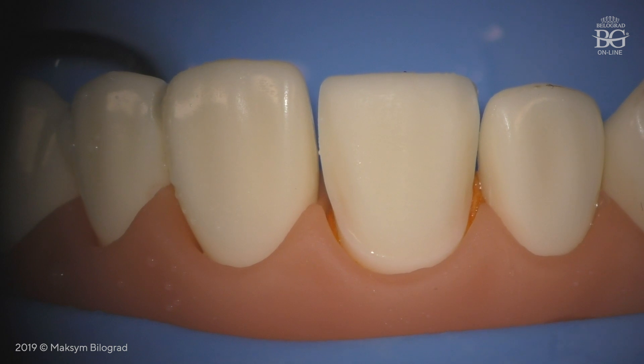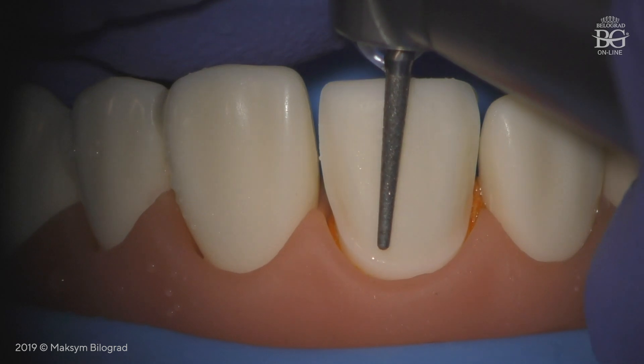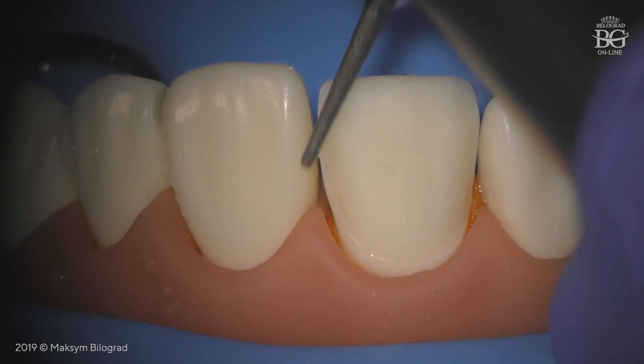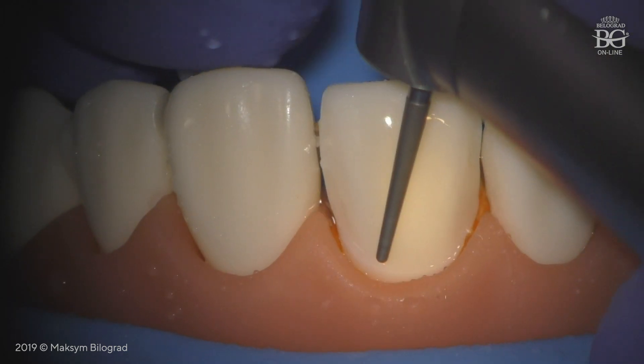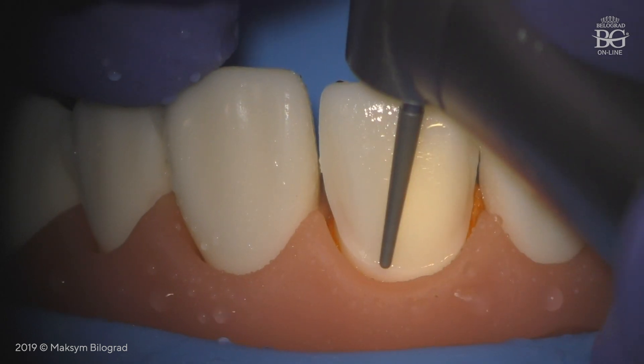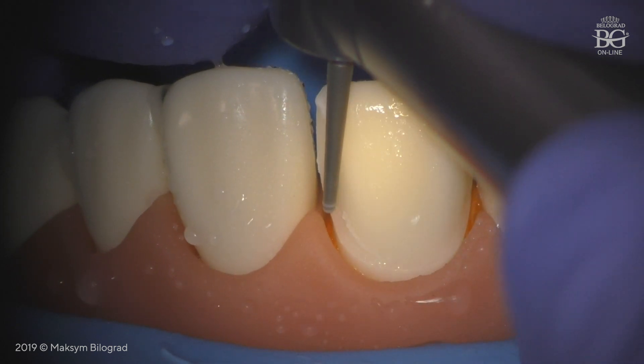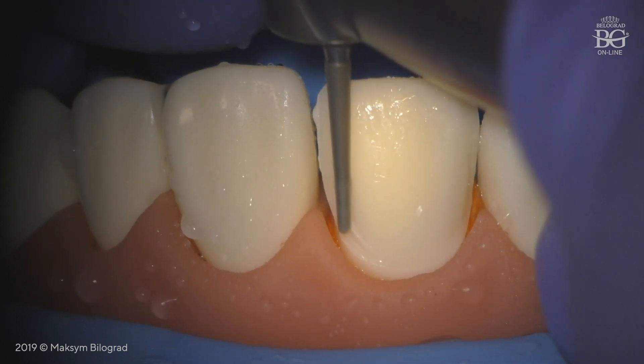In the opposite way, you have to prep the tooth in order not to have undercuts. The best position and angle of the bur is when the tip of the bur is driven towards the adjacent tooth. In this case, you will have no undercuts and a very smooth and clear transition from the buccal surface into the proximal area.